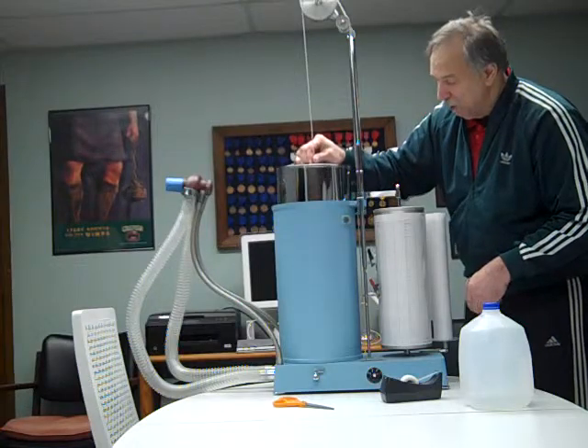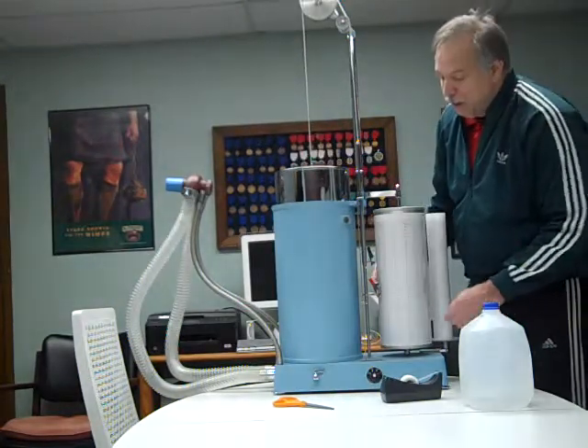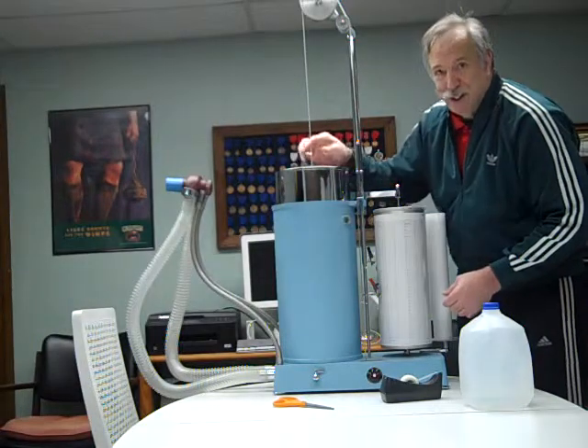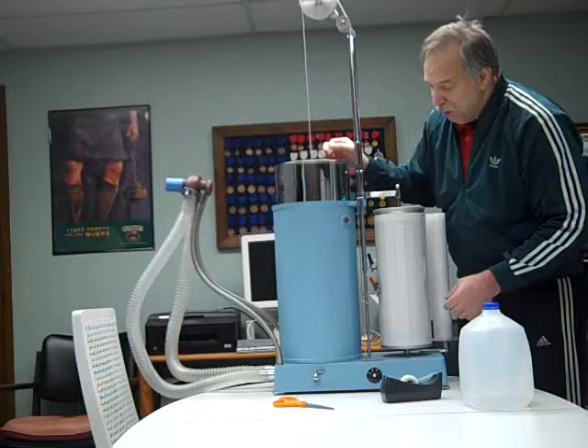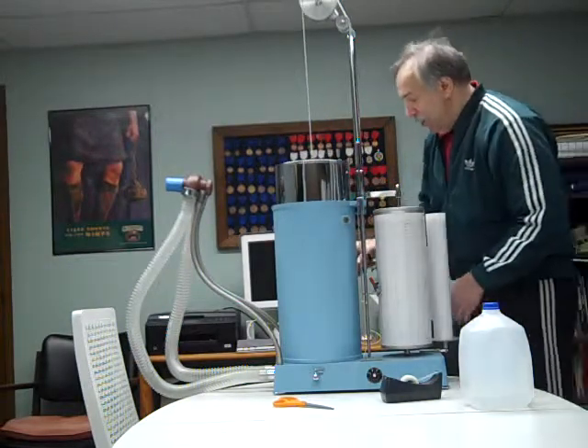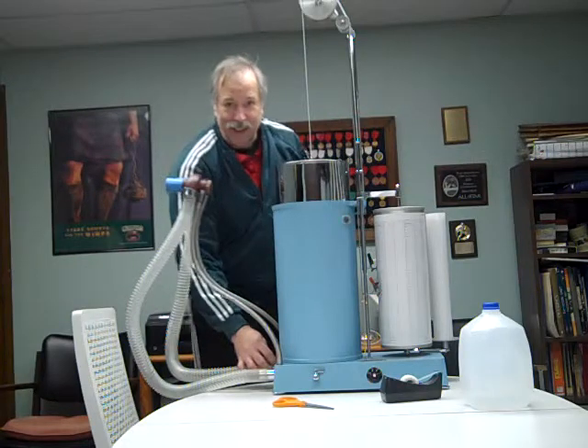That makes it very simple for the mathematical computations. We do have a port down here — if you're doing longer tests, you can add oxygen so your patient doesn't get lightheaded from having used up all the oxygen inside the drum. On the other side of the unit, we have a thermometer so we can make corrections for the volume of the gas.